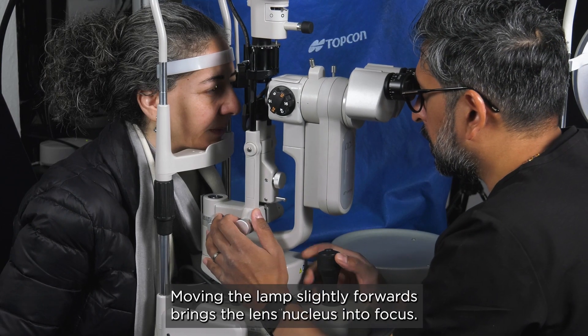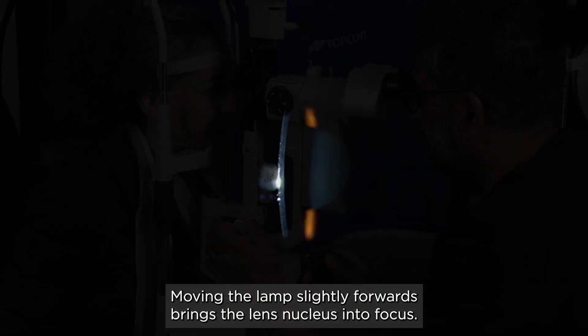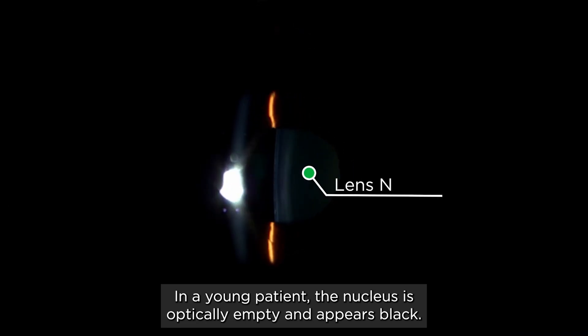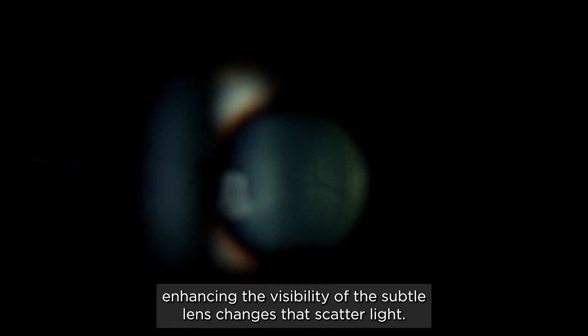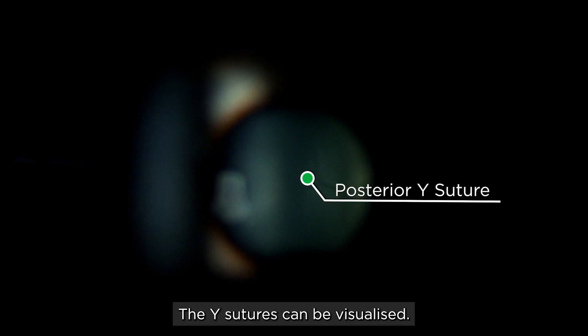Moving the slit lamp slightly forwards brings the lens nucleus into focus. In a young patient, the nucleus is optically empty and appears black. This slit lamp has an LED light source, enhancing the visibility of subtle lens changes that scatter light. The Y sutures can be visualized.